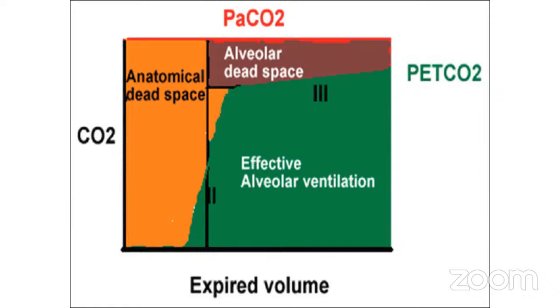So both you can identify in case of the perfusion ventilation mismatch due to hypotension, or whether it is anatomical dead space or physiological dead space. It is very good for ICU. Maybe cost is too high. I don't know. Yeah, anybody has seen?